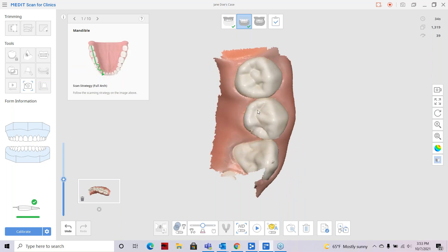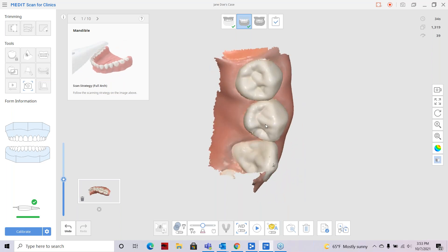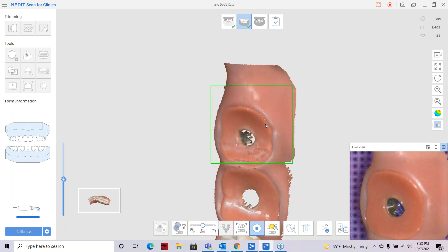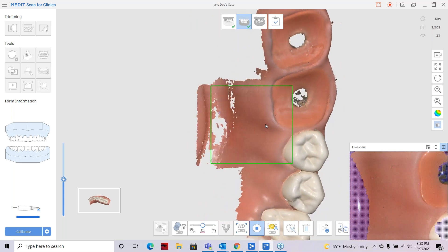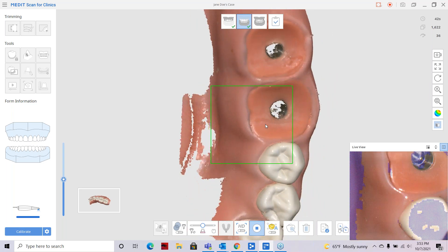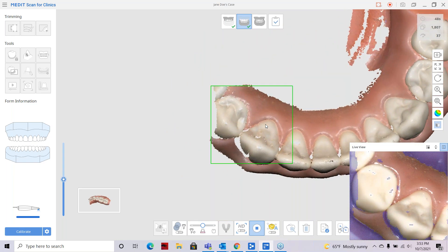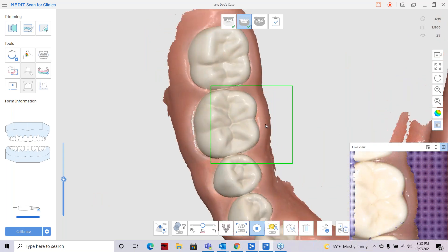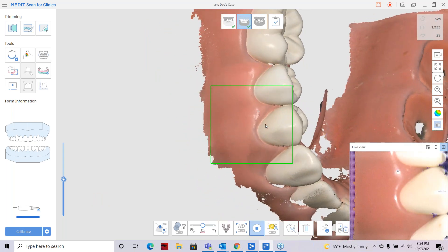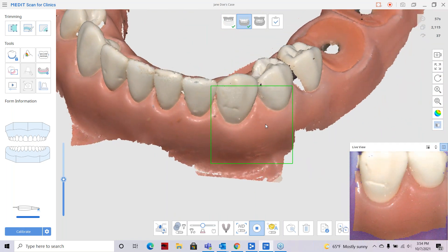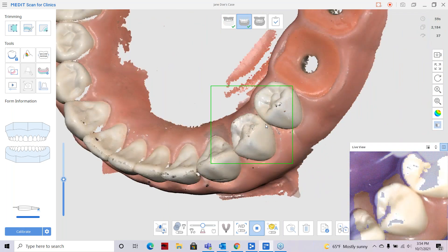From a thumbnail I've pulled up, I can start scanning based off of that thumbnail. Let's say I want to continue scanning towards the back and get some of that tissue. As I come across and work forward to the incisal edge, I still use that zigzag motion — and boom, the thumbnail on the left-hand side will disappear as soon as the software sees where the images meet up.